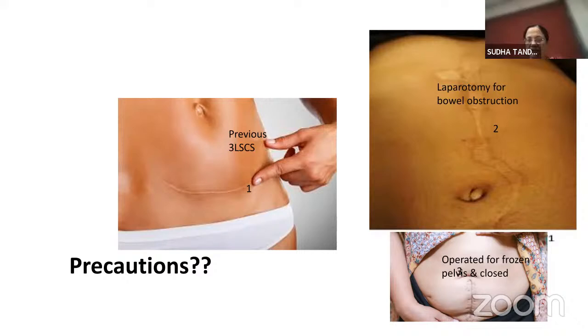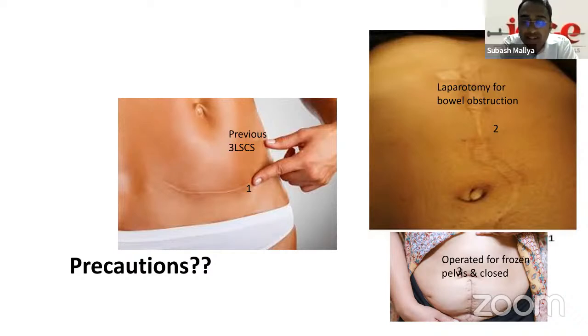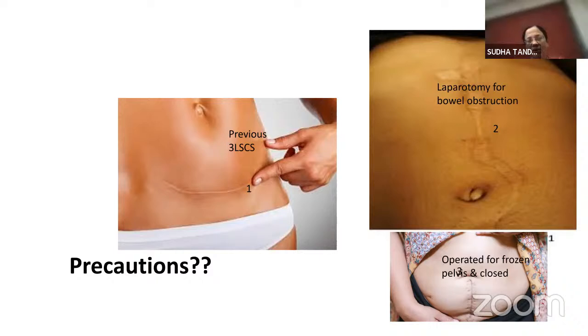So you could raise the intra-abdominal pressure while putting your 5 mm trocar. How much would you like to increase? In India, you can go up to 20, though Harry Reich has told you you can go up to 25. But in Indian women, I just go up to 20. That increases the CO2 bubble, so that you'll have more area to put in your trocar cannula. You just raise it for about 2 to 3 minutes.